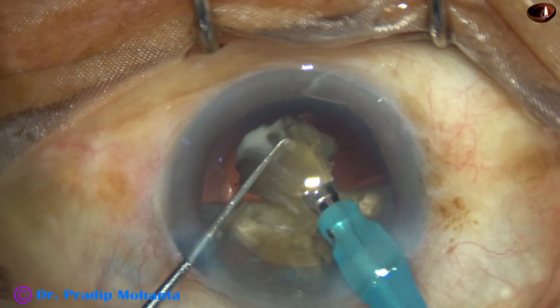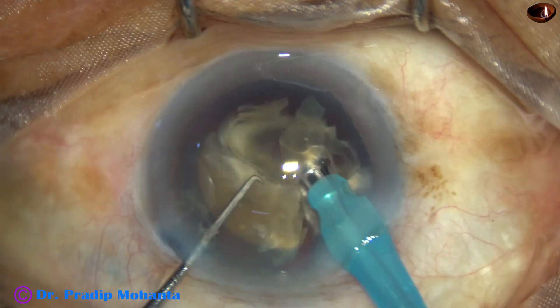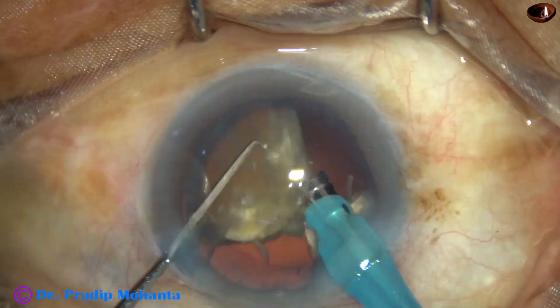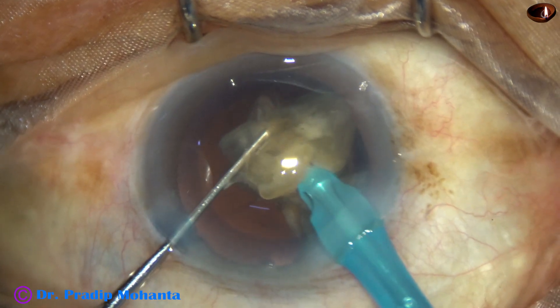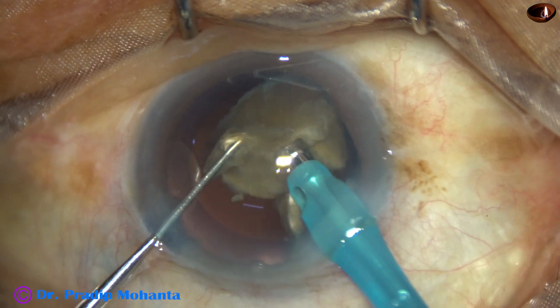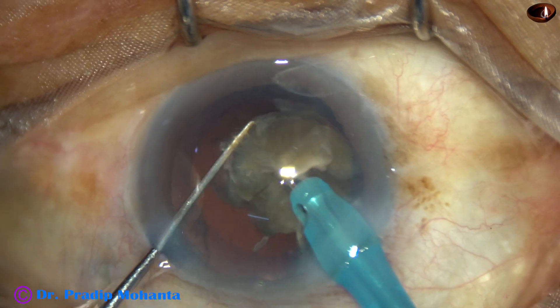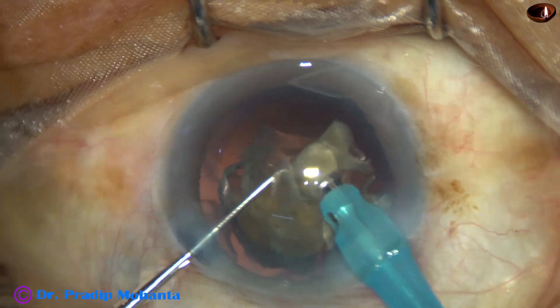There is no covering over the posterior capsule — no cortex. All the cortex is incorporated into the nucleus. So there is no cortex, no epinucleus; all these things are incorporated into the nucleus.